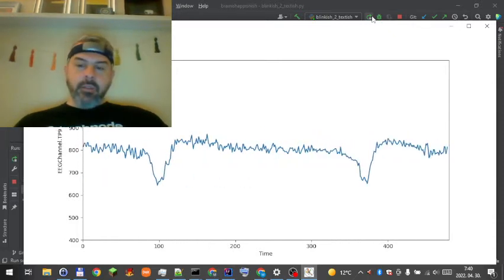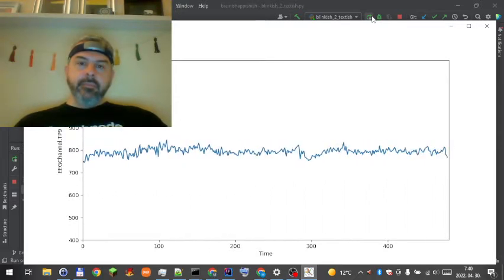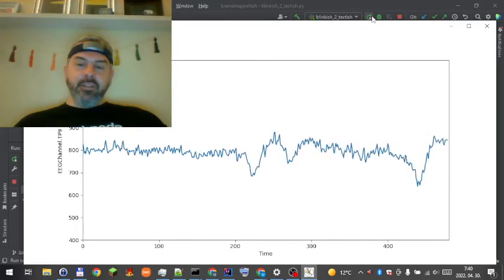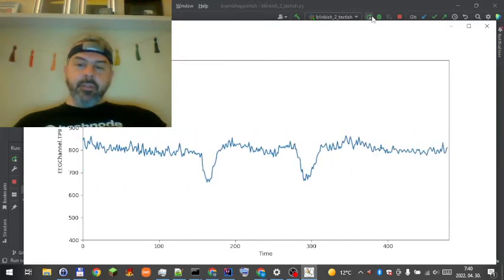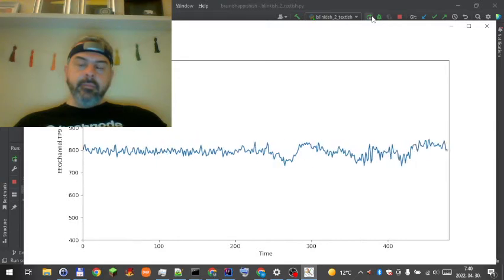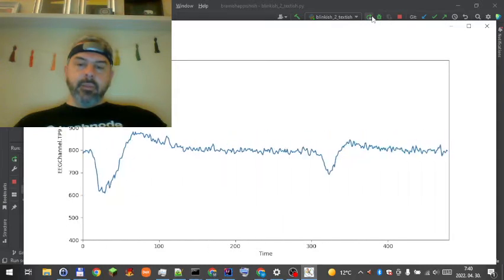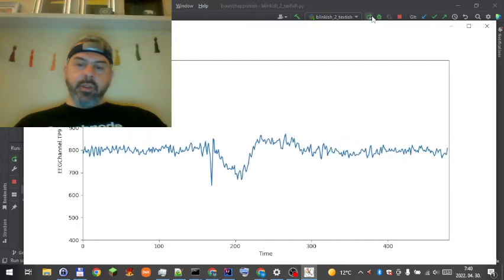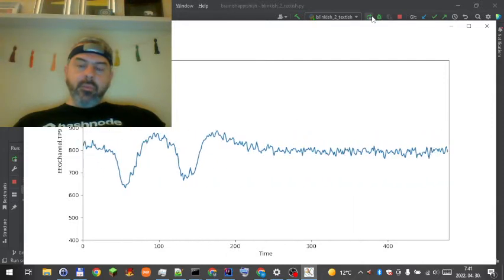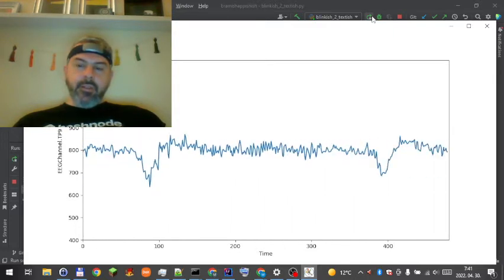How my EEG signal looks like when I'm not doing anything. You see? It's almost a normal line. Of course, there's some oscillating in it, but it's a normal line. Now, let's see what happens in case I blink. You see? There's a huge drop in the amplitude, and there's an increase in the amplitude which goes back or even more higher than the median value. Let's play a little bit.